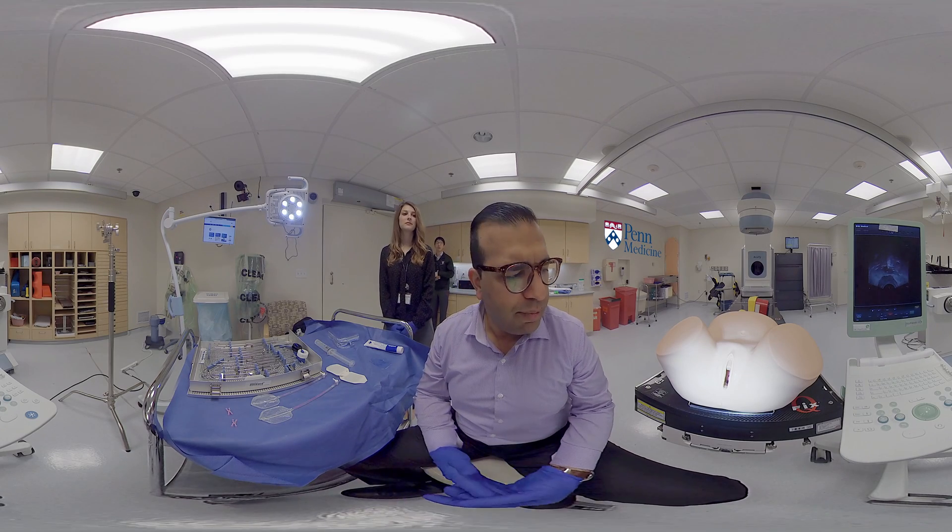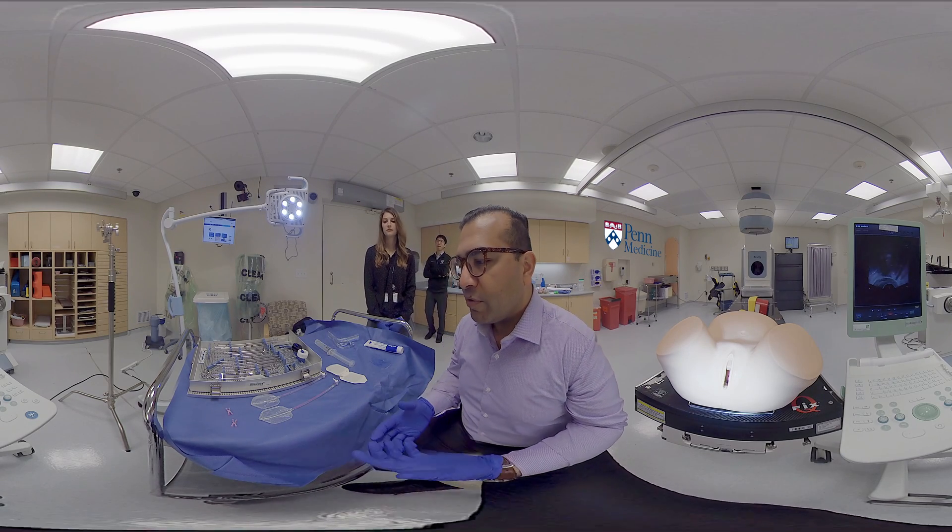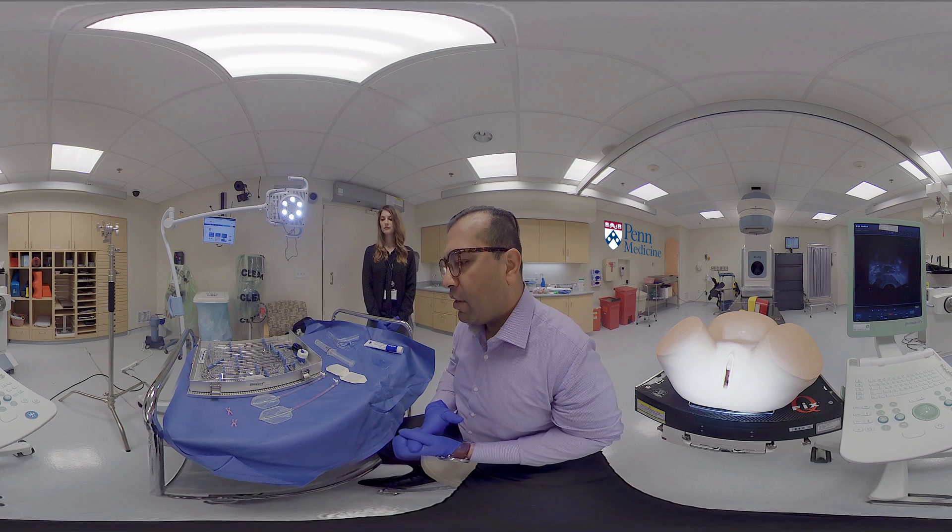Good morning. Today we'll be demonstrating insertion of a titanium tandem and ring applicator.